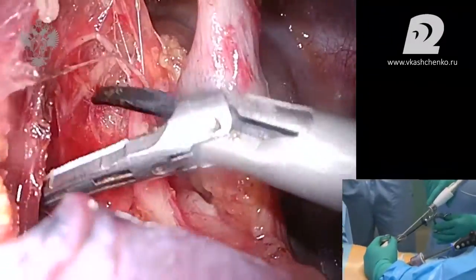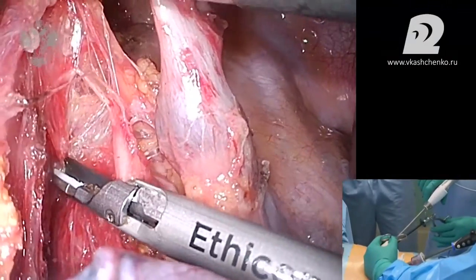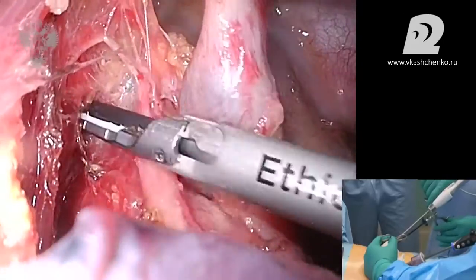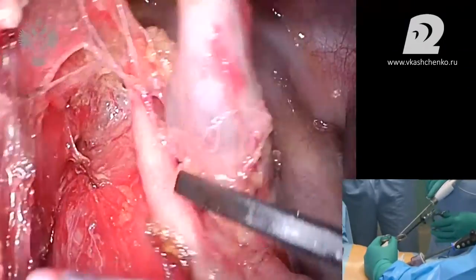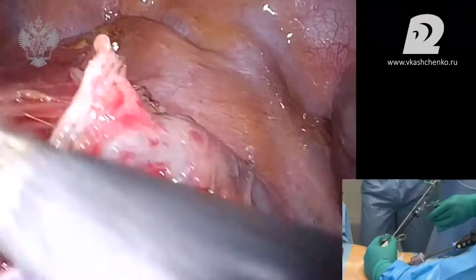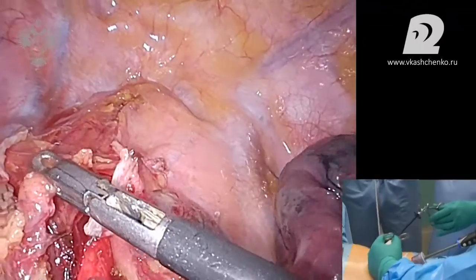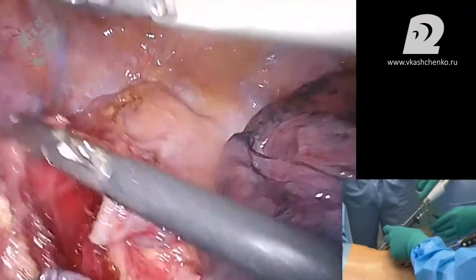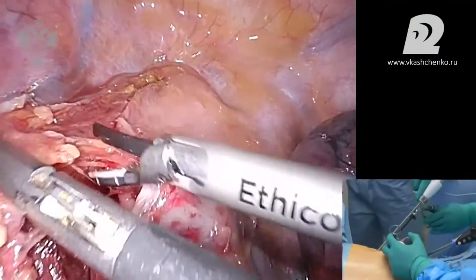Bronchoscopy is a parallel procedure. It's being carried out simultaneously. Would you like to stay in the air, or shall we switch? What is more comfortable for you, depending on what the floor wants, what people would like to see, to watch.